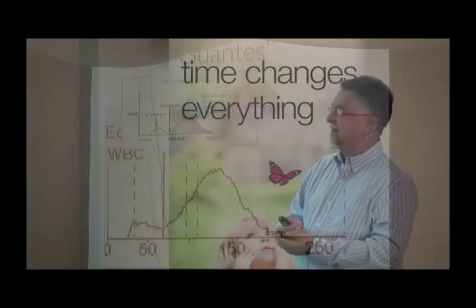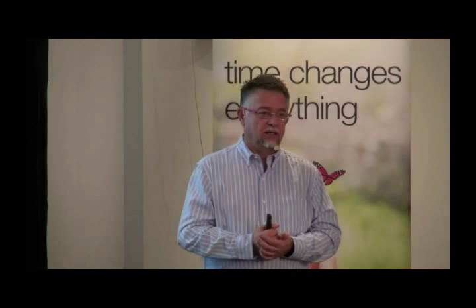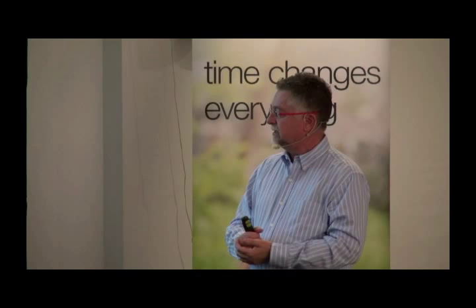But let me show you the blood smear. This cat does not have one normal neutrophil, all right? It's severely left-shifted, even metamyelocytes. So this cat is really in deep trouble, all right? So I tell this veterinarian, this cat is really in trouble, find out how the cat is doing. The cat is already dead, all right? Two hours after the cat was admitted, he died.